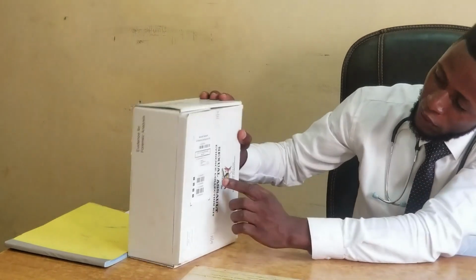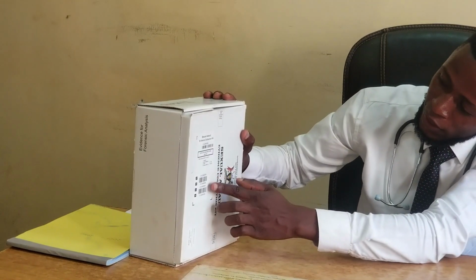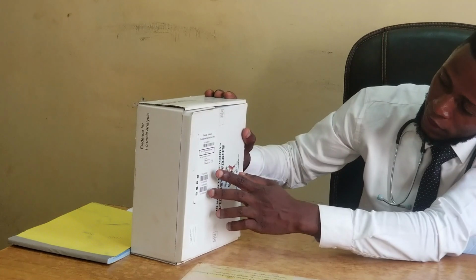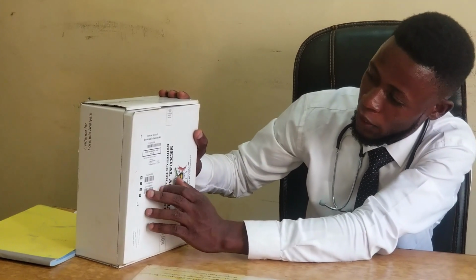It has a serial number, and the date it was manufactured. Then it always comes with a seal and a serial number. In case you don't see this serial number, please don't take it. Then the expiry date. A kit without a serial number is invalid.